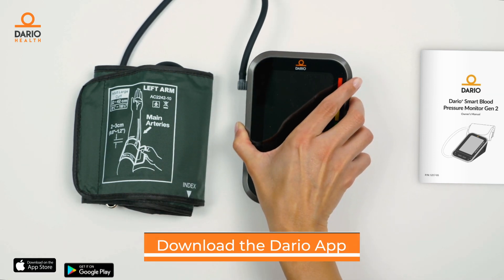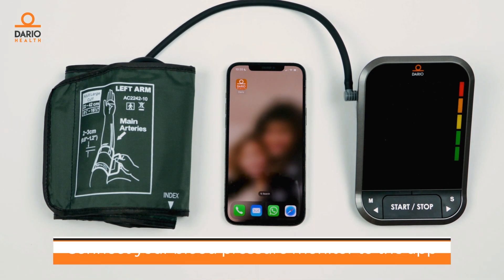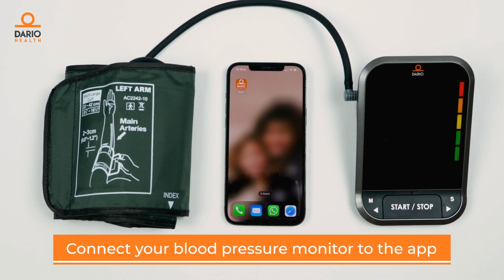If you haven't downloaded the Dario app, now is the time. The next step? Connect your Dario blood pressure monitor to the app.